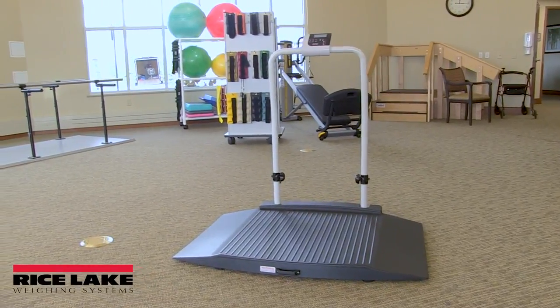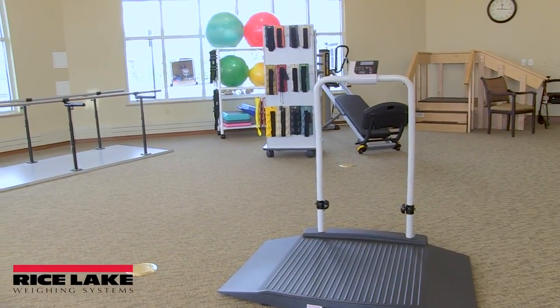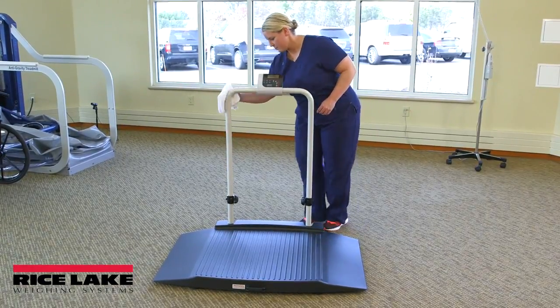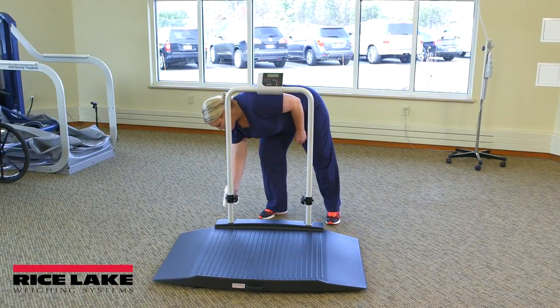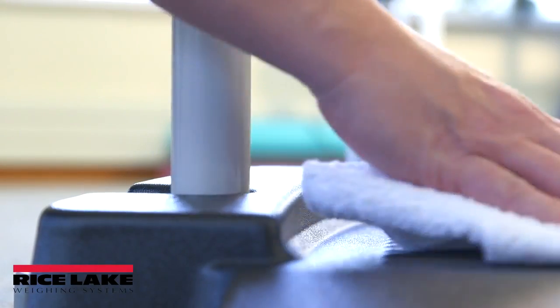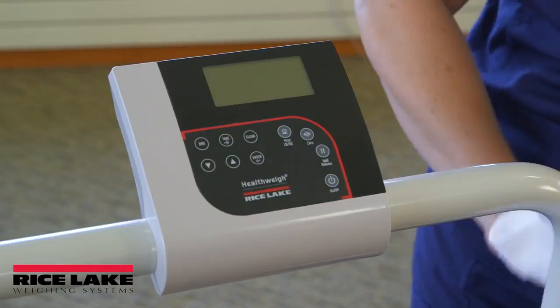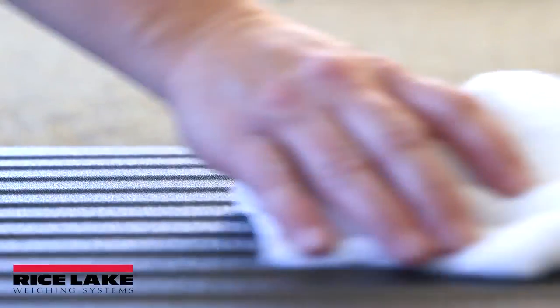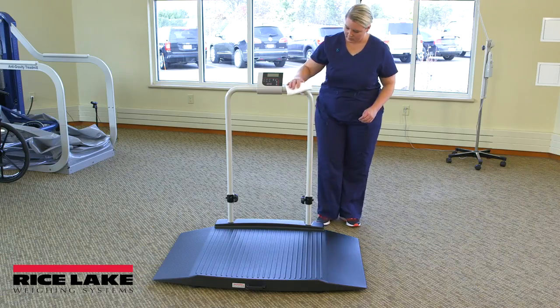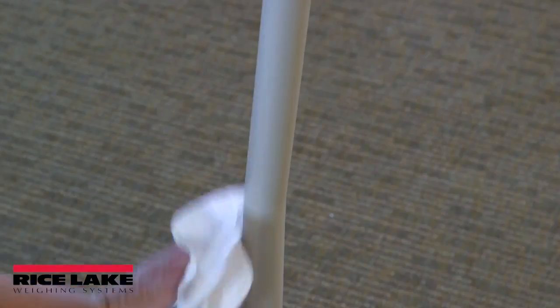Proper care and cleaning is essential to ensure a long life of effective operation. Rice Lake's wheelchair scales are easy to clean. Simply disconnect the scale from its power source and use a damp cloth or tissue to clean all external surfaces. Mild soap and water may be used; however, isopropyl alcohol should not be used as it may damage the display surface. Dry with a clean, soft cloth.